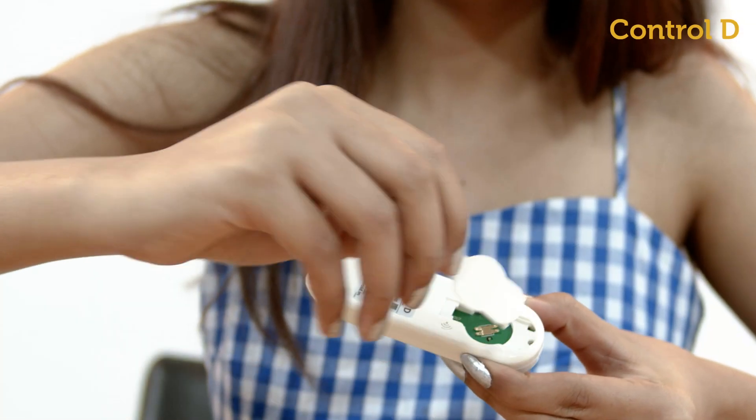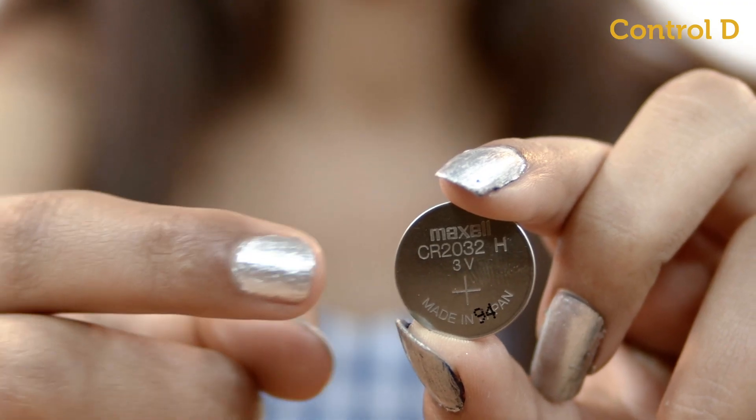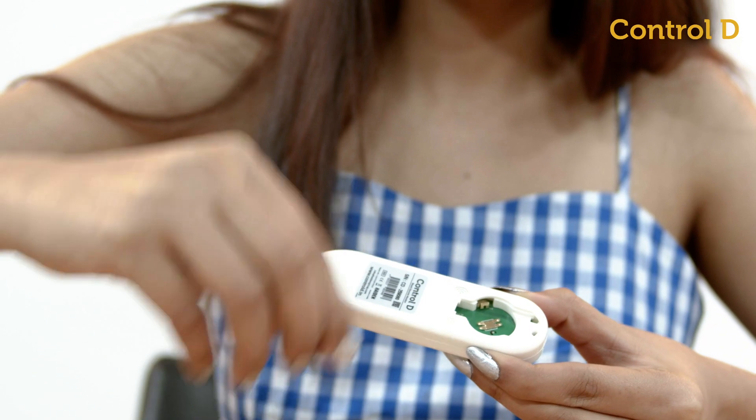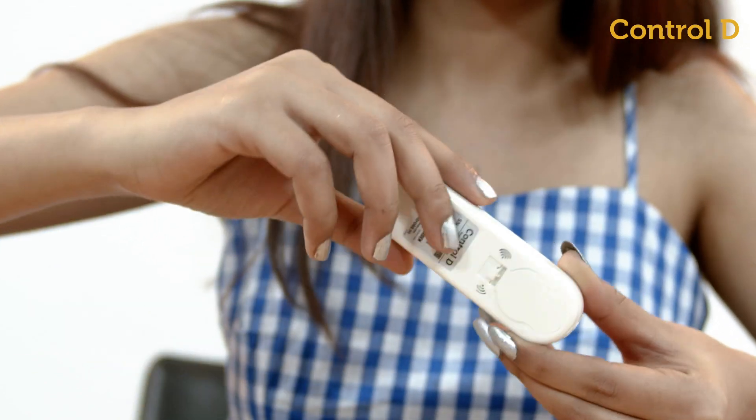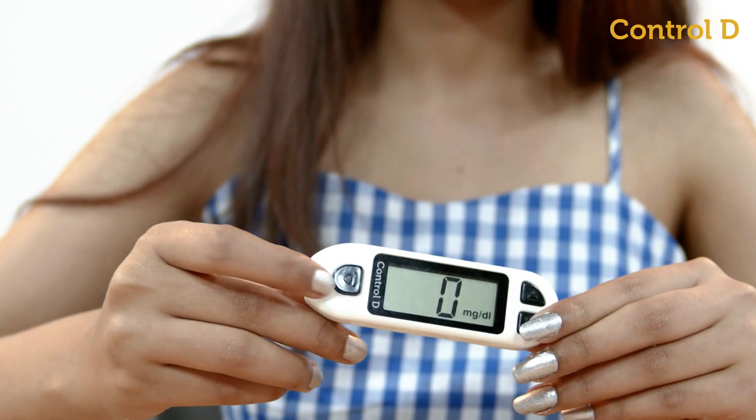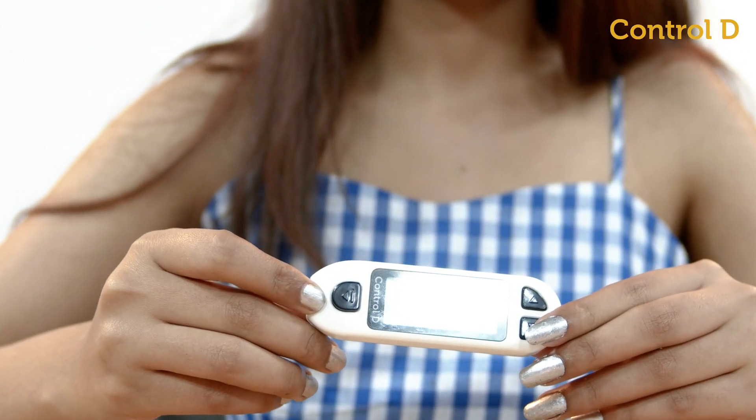To get started, insert the battery with the plus side facing up. Press the arrow button to check if the glucometer is functioning.